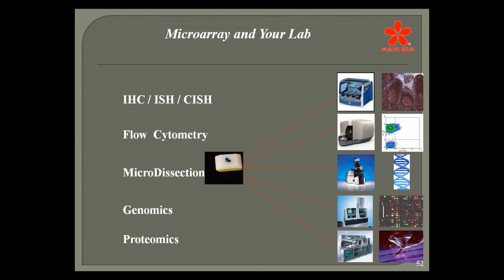as many of us well know, that may be involved with flow. Microdissection, where you can actually take a group of cells, a specific entity, or even one cell out of a tissue, off of a tissue slide, provided that it's not on a positively charged slide. You can lift these off, mount them on a slide, and then stain them with whatever stain you may wish. It will be a very nice array of sections specific for what you're looking for.